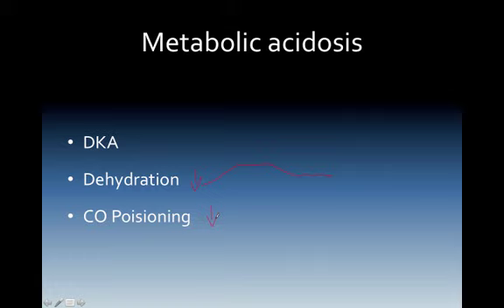At the point that they start normalizing at the cellular level, and we may not be able to do this with the CO poisoning, then very simply we will start to normalize our patient. So with CO poisoning, we may see low end-tidal CO2 presentations, and then hopefully as we start correcting them, they will also rise, or they may just stay exactly the same.